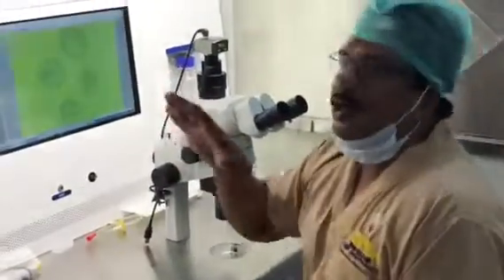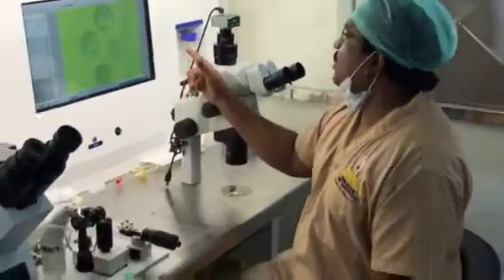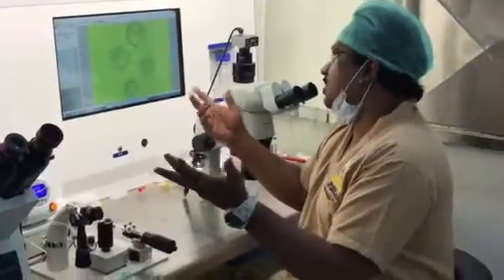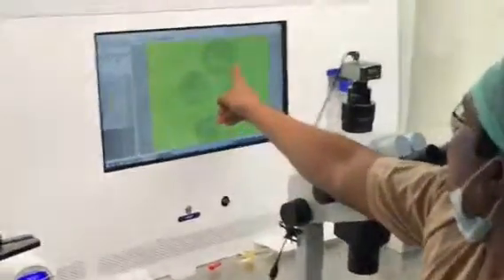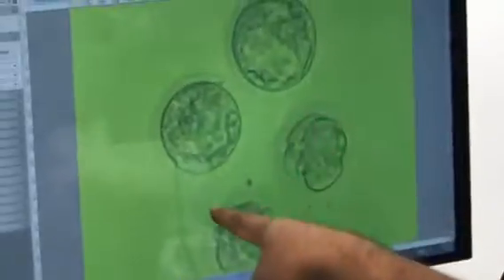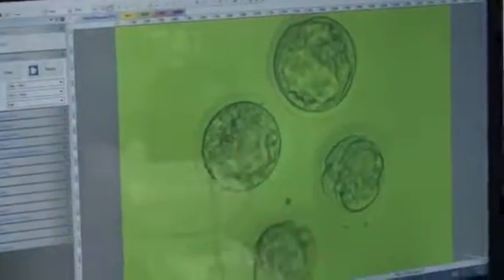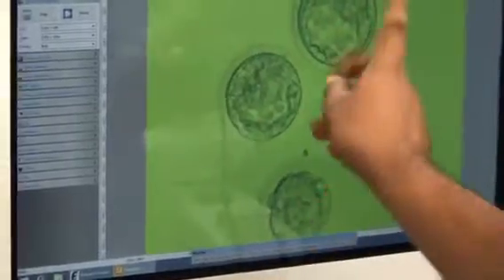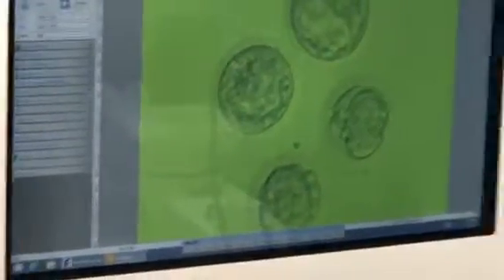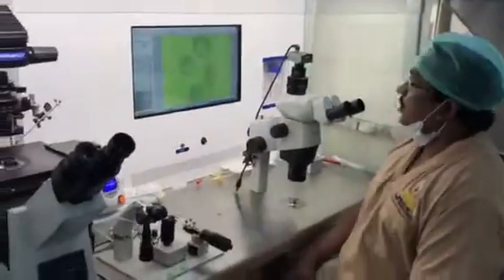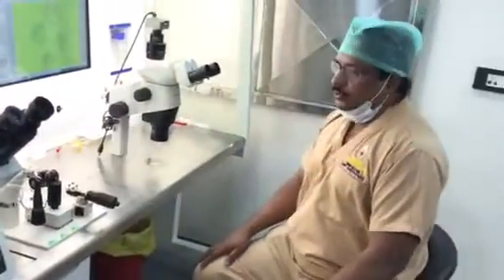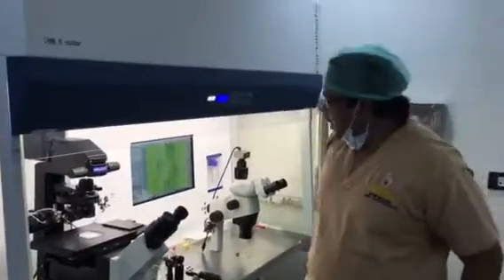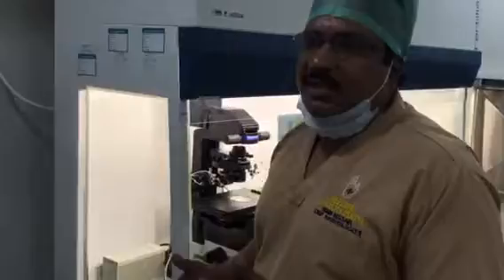This is a frozen-thawed blastocyst. We didn't record post-thaw but somehow forgot. This is a 4AB and a 3AB, and one early blast. We didn't transfer this one — we transferred the other — because this is a repeated failure patient.